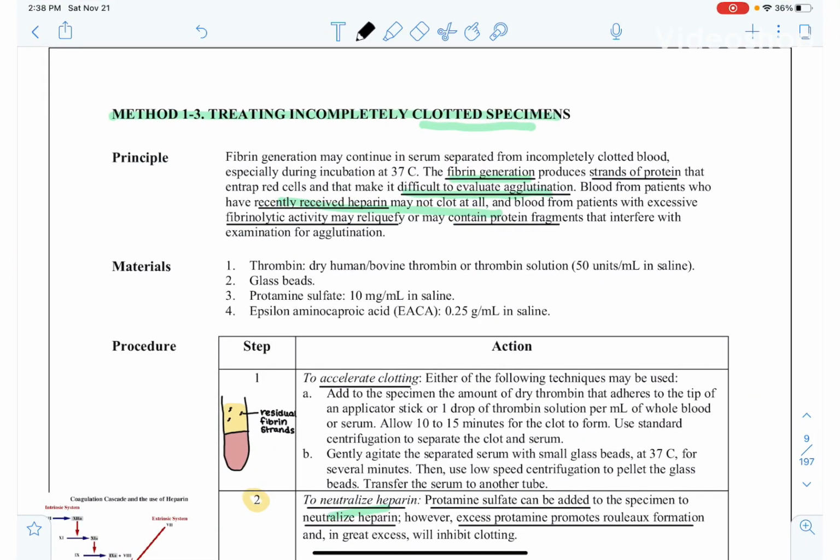This week we're learning about pre-transfusion testing and serological systems. There's a lot of reading material, so I created this video to help you cut down on reading. If you'd like clarification, refer to the Word document posted in Blackboard.